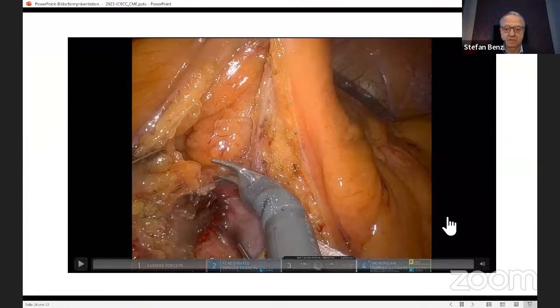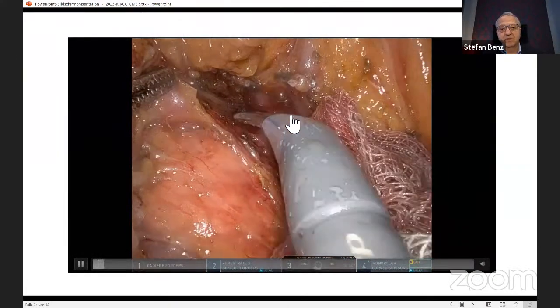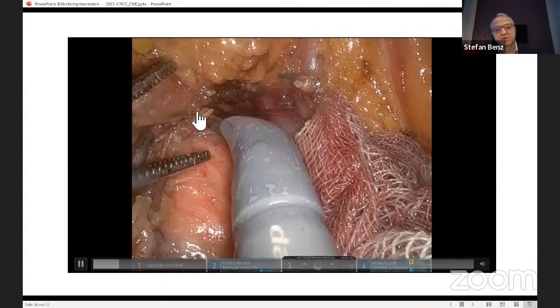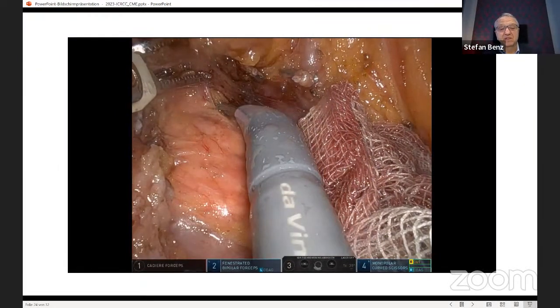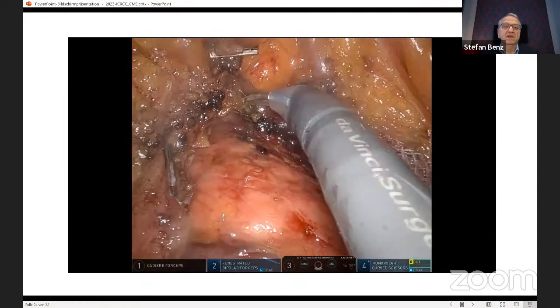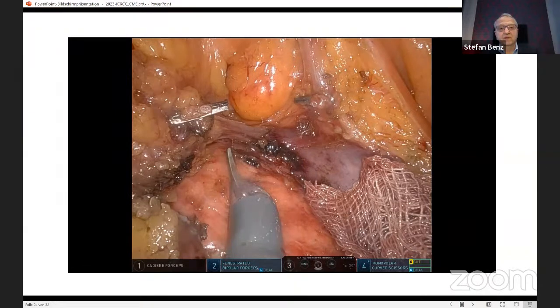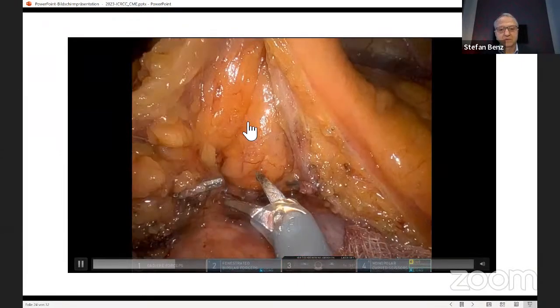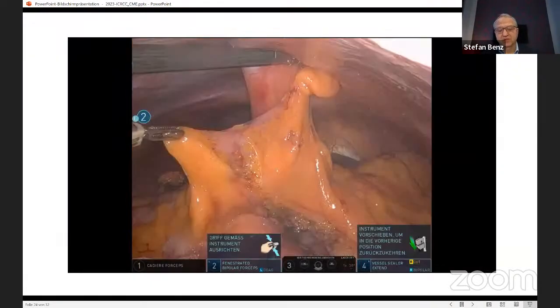And so we have now the superior mesenteric vein here, Henle trunk. There is a lymph node behind the Henle trunk, which is dissected away, which with a robot is easier than if you do it with a laparoscopic setting. And in the end, you go around the superior right colic vein, and that concludes the central dissection.